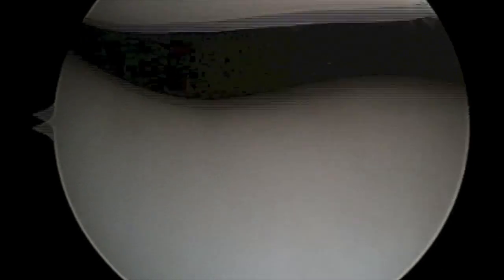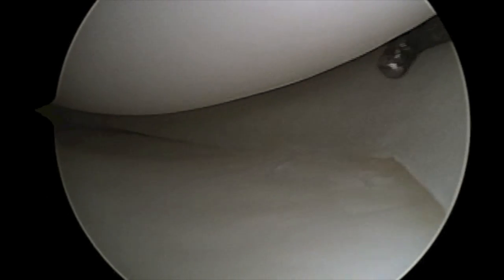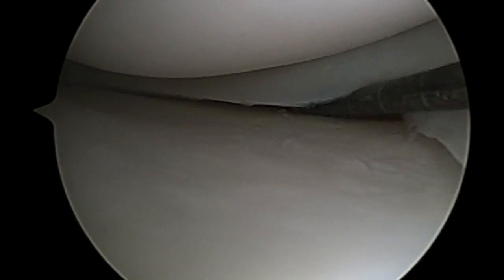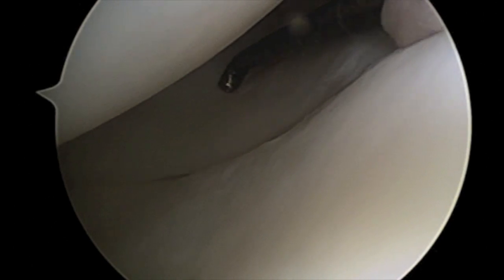A diagnostic arthroscopy of the knee is performed, which in this patient demonstrates normal articular cartilage of the patellofemoral joint. The medial compartment is then inspected for articular cartilage disorders and/or meniscus tears using an arthroscopic probe.